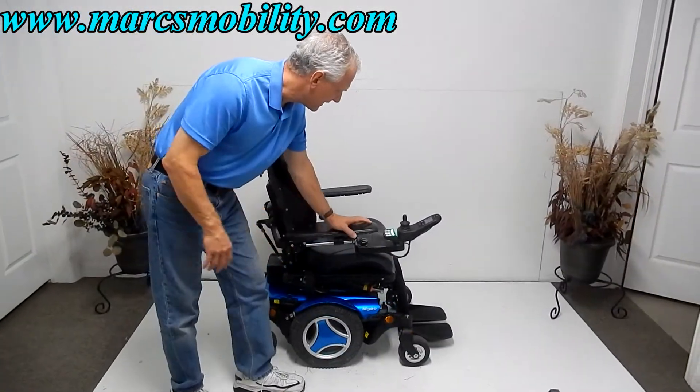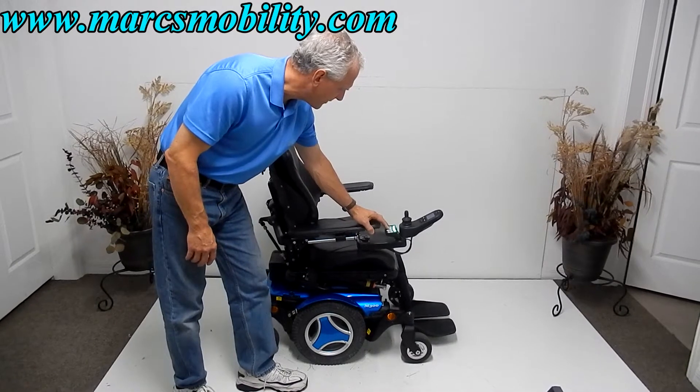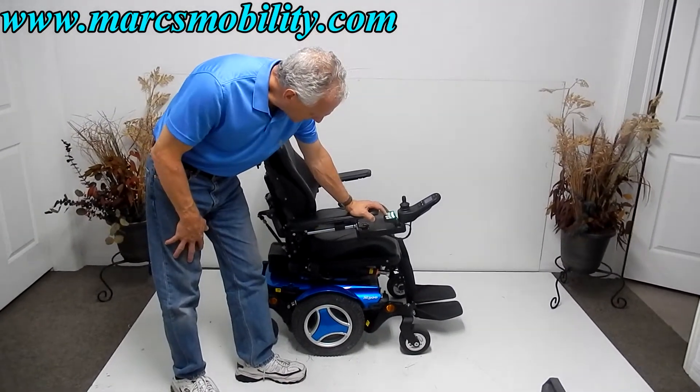The next thing I'm going to show you about this chair is the electric tilt. I'm going to do the tilt right from here. So this would be your electric tilt.